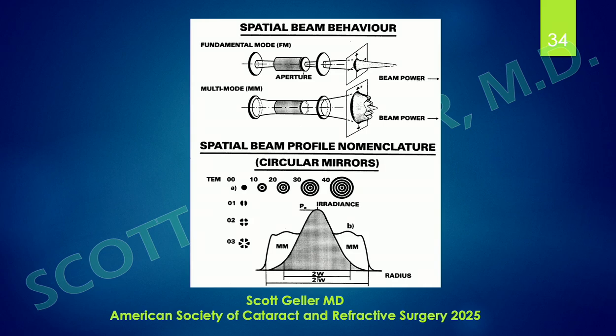And here we go again, which goes over the spatial beam behavior and the beam profile nomenclatures. The nomenclature that's important to us is TEM00, which gives you a perfect beam wavefront.